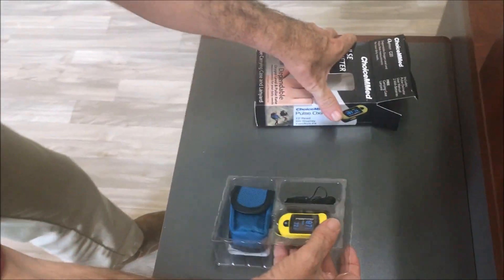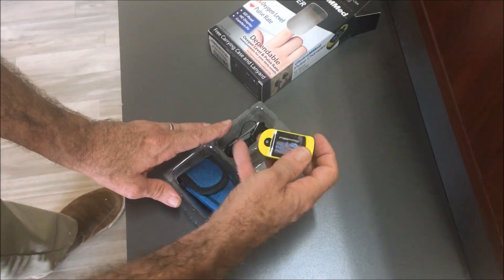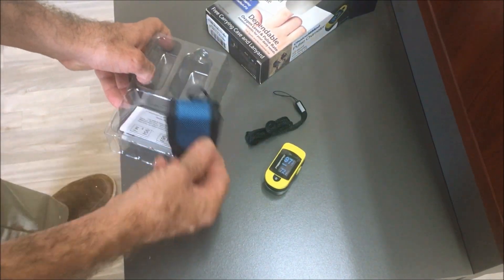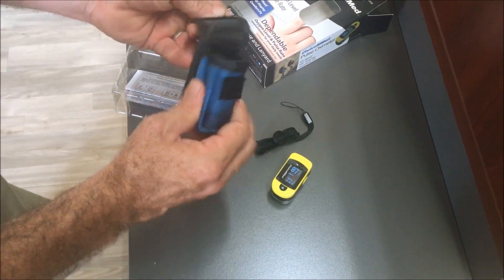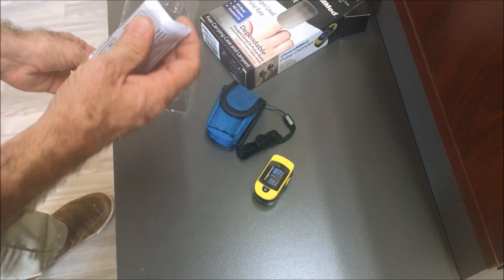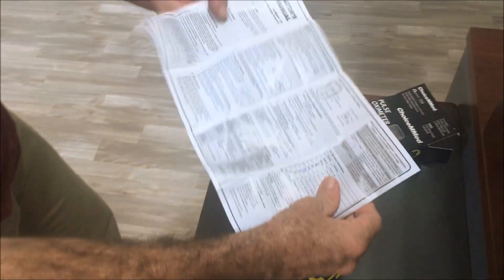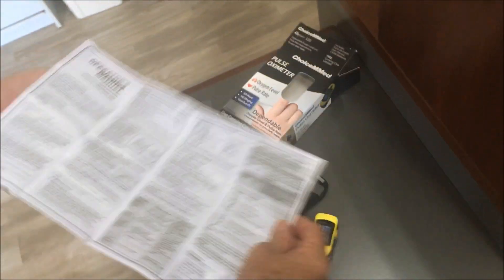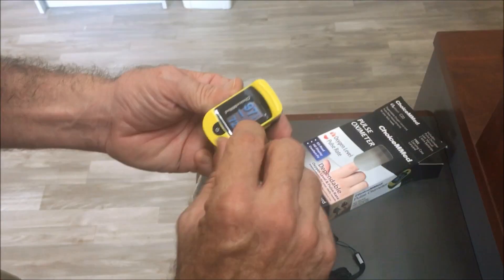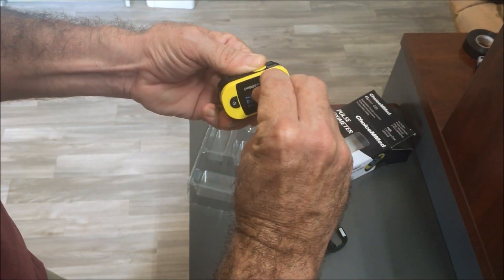I'm just going to unbox it to show you exactly what you get. Whenever you purchase one of these and have it shipped to your home, you get your pulse oximeter, a nice little lanyard, and a cool little carrying case that looks like it's made of canvas — very durable. You also get instructions, which I recommend everyone read through and follow.